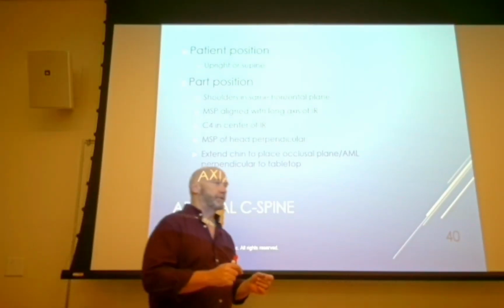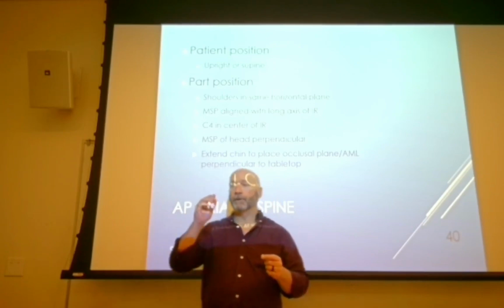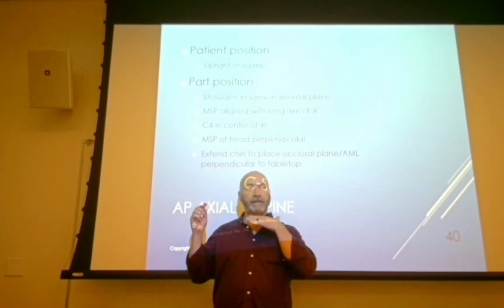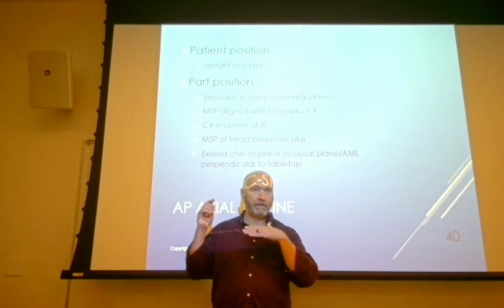But if the patient's out of a collar and they can move, the acanthomeatal line is perpendicular to the image receptor, and this is as if I'm shooting this upright, AP is going to be 15 to 20 degrees cephalic angulation.